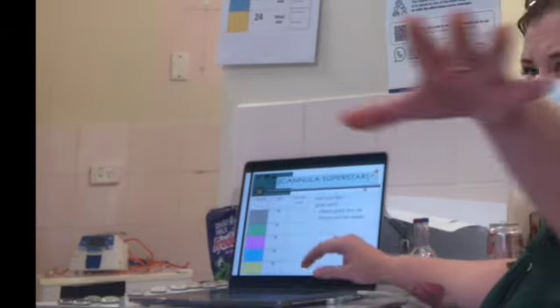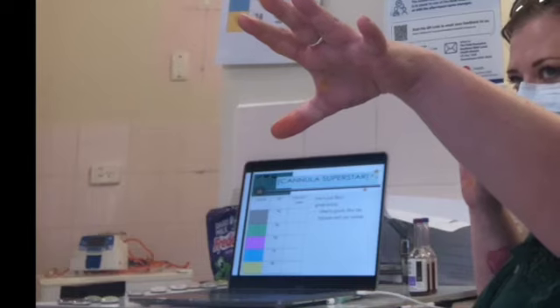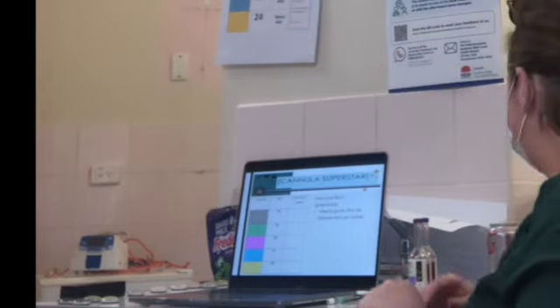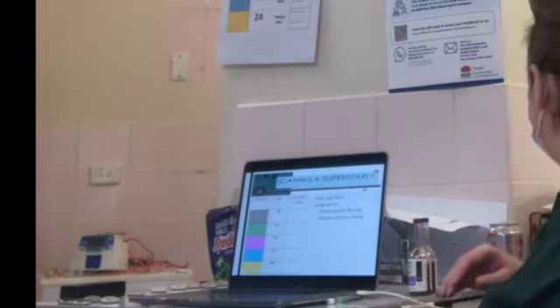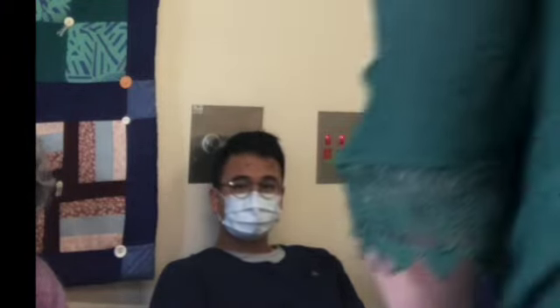Right, so I've got our pretty rainbow coloured IV fluid charts. I'm just anticipating how messy this is going to be. If we aim for these container sizes, I'll get some fluid. We're going to time how long it takes to get 100 mils through. Does someone have a stopwatch on their clock?